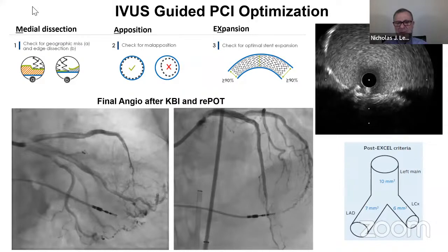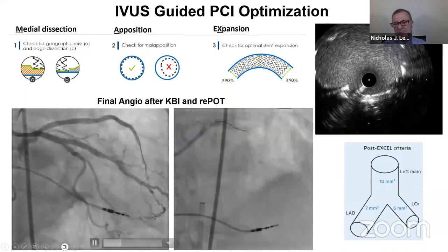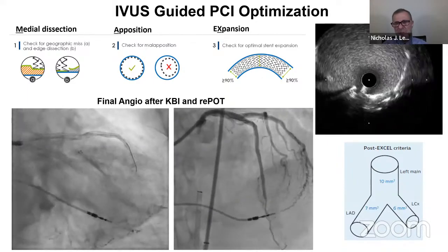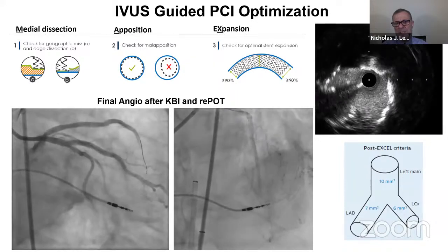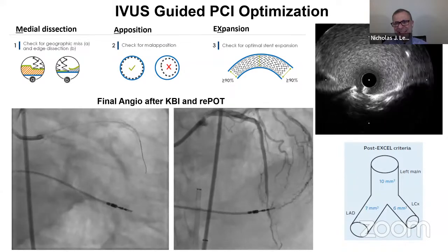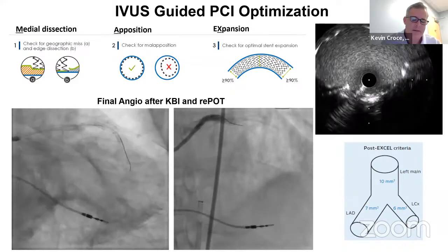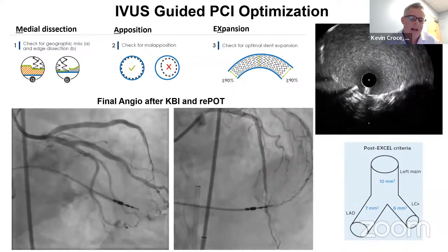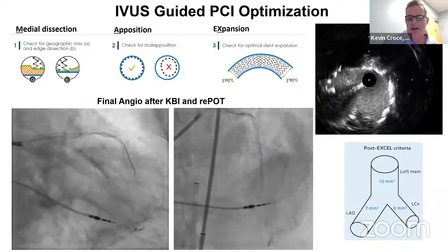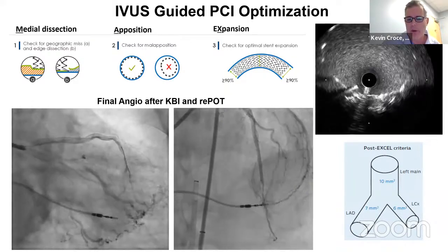We talked a little bit about using stents that had extra radial force and maybe extra scaffolding that Akiko mentioned may be helpful. But in a 111 calcified nodule, proximal, what stenting technique would you apply to that? I talked to some colleagues in Europe about frustration with both acute and early stent scaffold failure on nodules, having personally had a bunch of these.